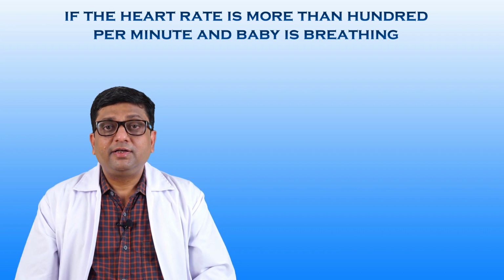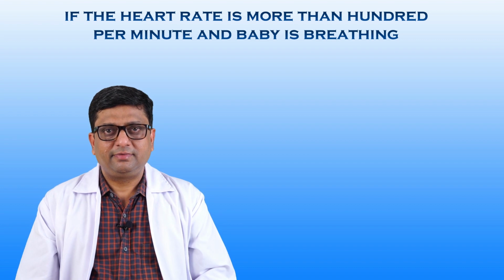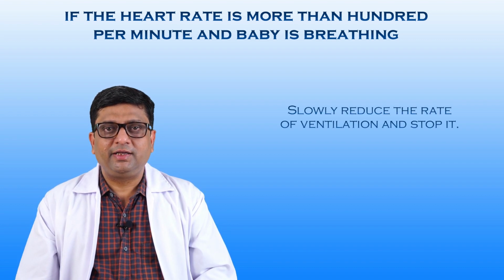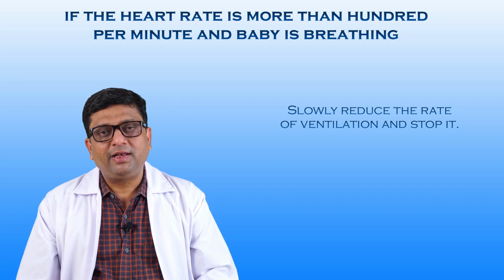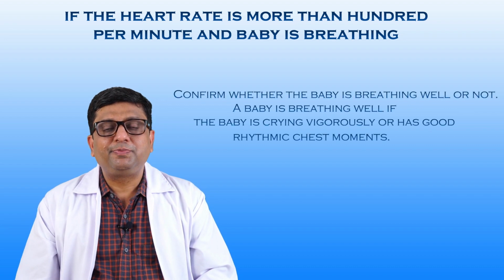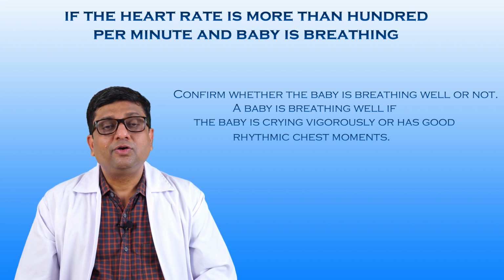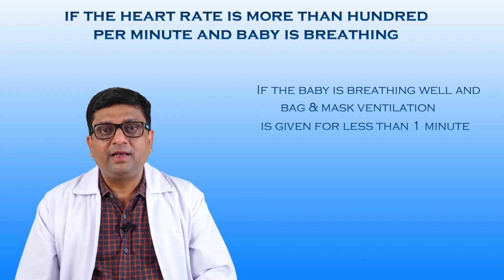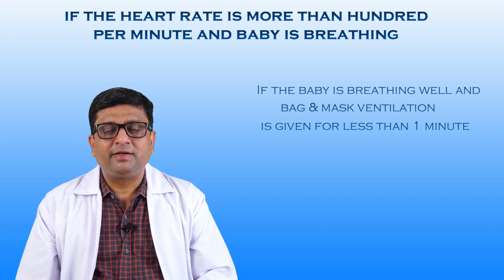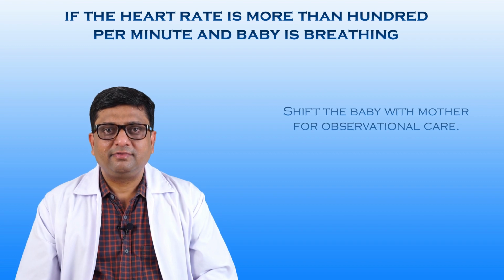If the heart rate is more than 100 per minute and the baby is breathing, slowly reduce the rate of ventilation and stop it. Confirm whether the baby is breathing well or not. A baby is breathing well if the baby is crying vigorously or has good rhythmic chest movements. If the baby is breathing well and bag and mask ventilation was given for less than 1 minute, then shift the baby with the mother for observational care.